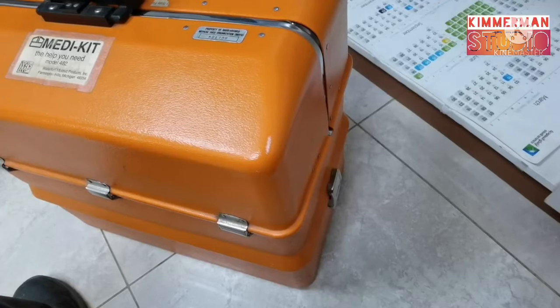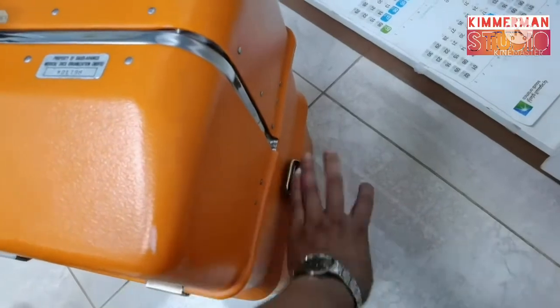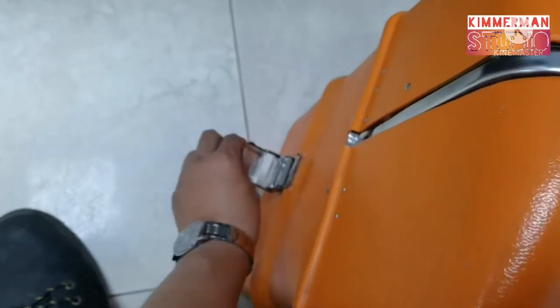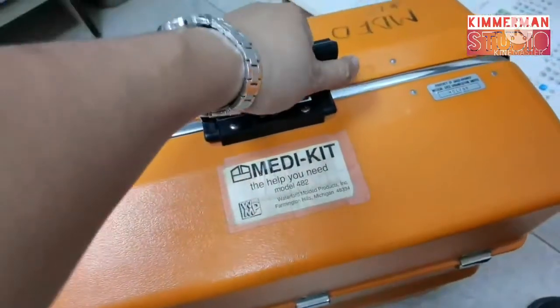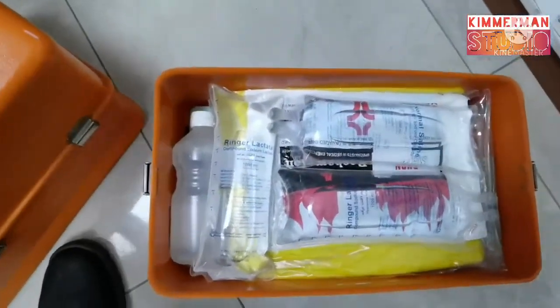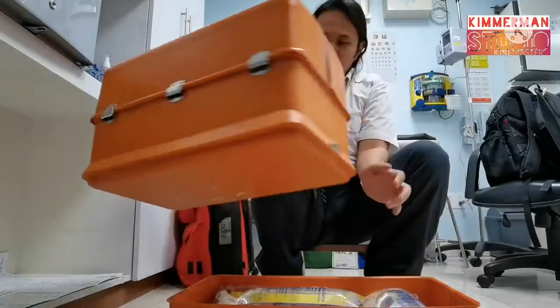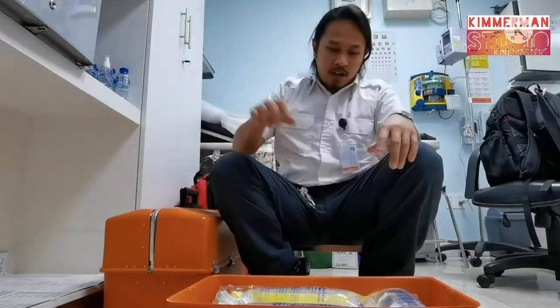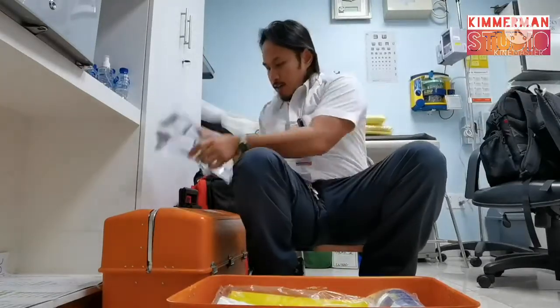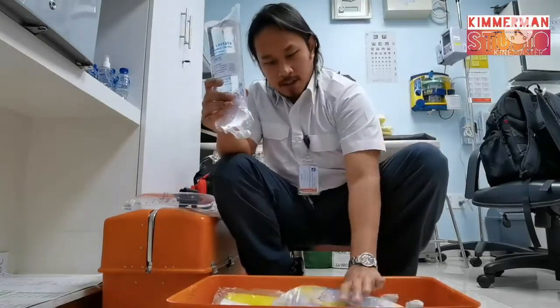Now we will reveal the second compartment, the lower compartment. Open the sides, the clips here, and lift the upper compartment. There you go. Lift this up, and there you go. Second one you have here, Hartmann's, Ringer's, normal saline, 1 liter. Another Ringer's, and another normal saline.